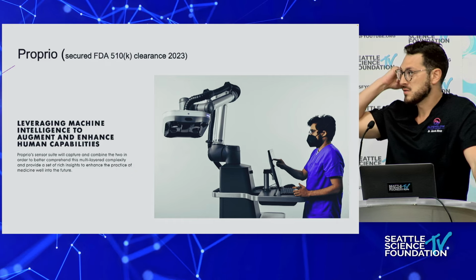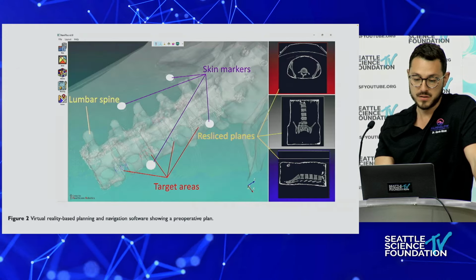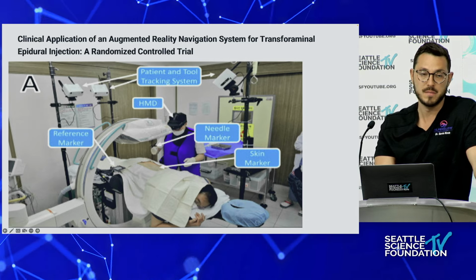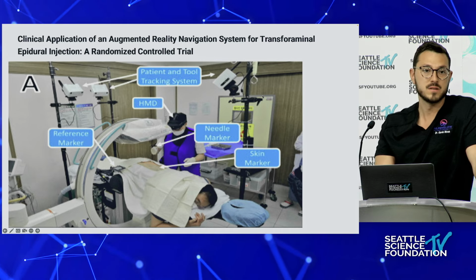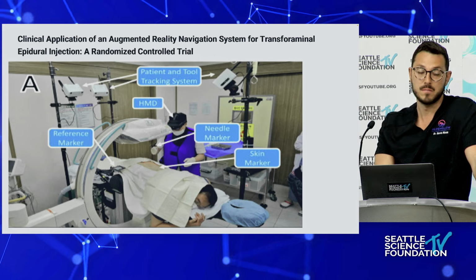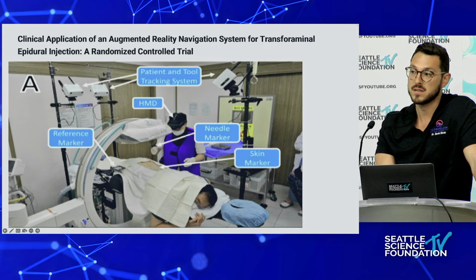Where I see this going is that patients will probably start to be scanned with reference trackers on them at baseline. And then, if you have a procedure suite, I don't know what the cost of this is, but it's going to require these tracking cameras over the patient. It may be one, it may be two, but this at some point is probably going to become somewhat standard of care. The cost is going to have to come down. This may be something that is pushed more in the academic space, maybe not, I'm not sure. But if this makes our job easier and safer, then it'll probably be adopted within the next 5 to 10 years.